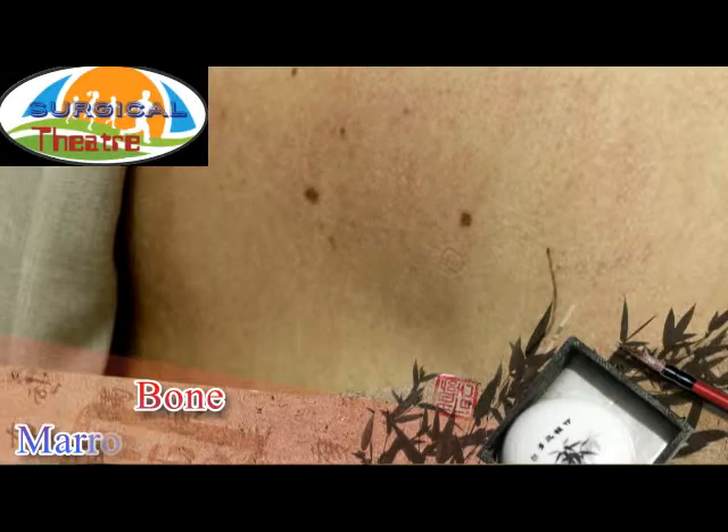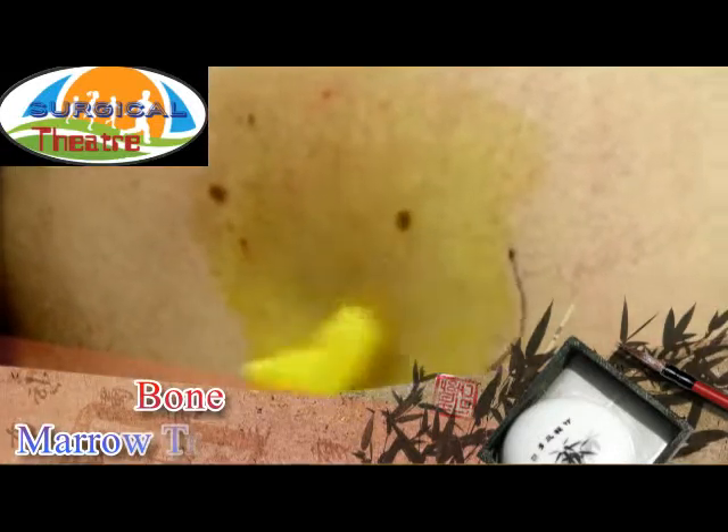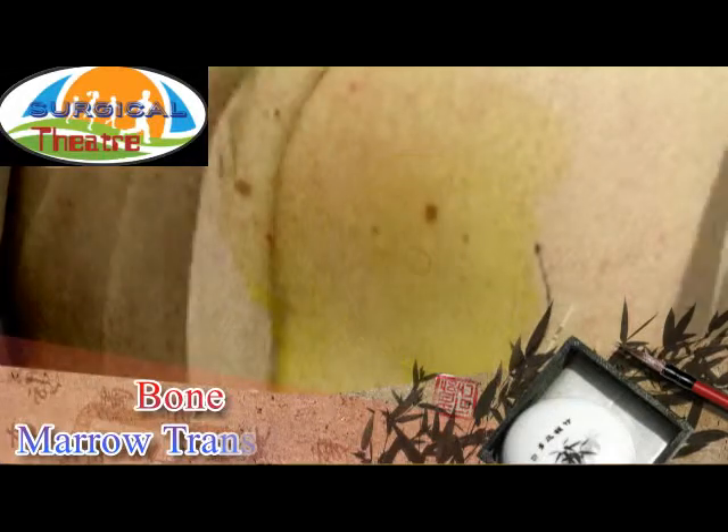This is to avoid losing the marking after washing. The area around the puncture point is washed with colored chlorhexidine. The procedure is carried out aseptically, but without sterile drapes. The area around the puncture point must remain sterile during the whole procedure.